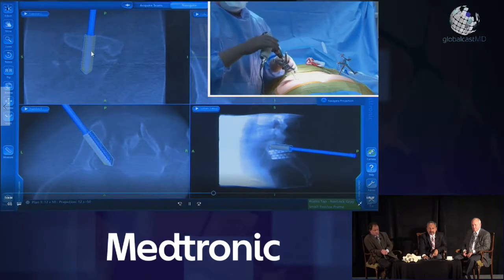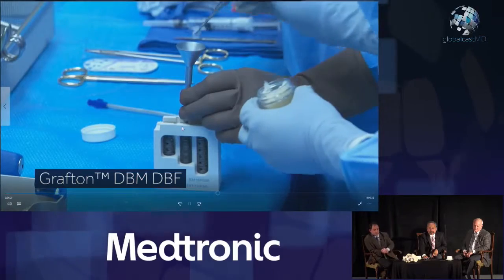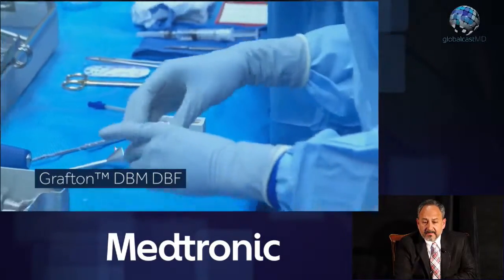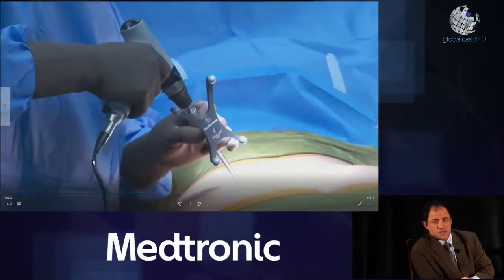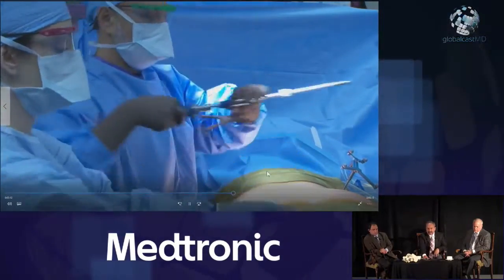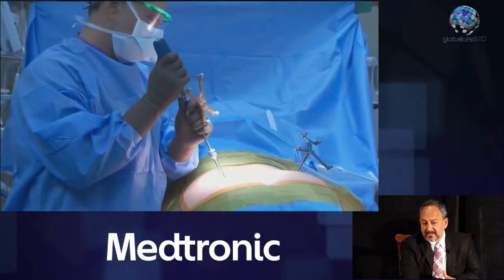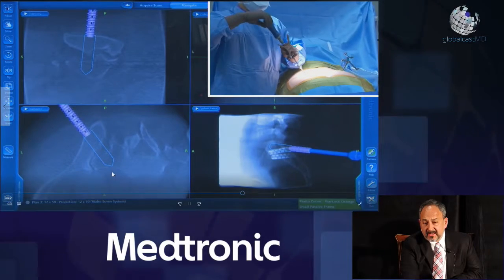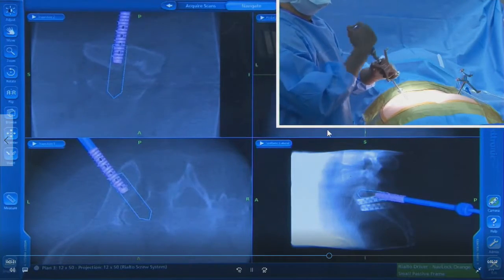Here we've basically measured backwards from the tip to give us an idea of how long an implant we're going to use. We've chosen the middle size implant, which is 50 millimeters. We're packing it now with graft — that's Medtronic's preferred pairing with this product; it's on label, demineralized. I'm removing the tap — I left it in just to keep the bone from bleeding. Because of the navigation, I can line that up beautifully on the first shot, and using hand torque I'm going to bring that implant all the way down across the joint.